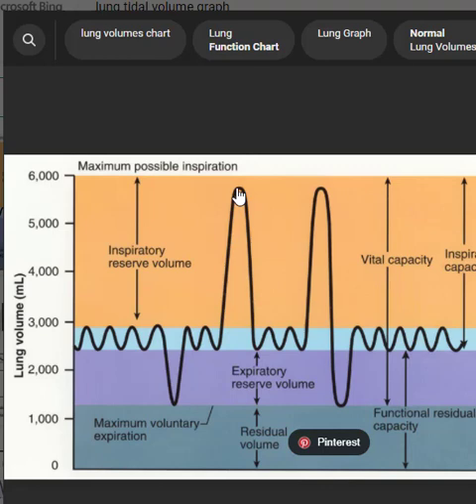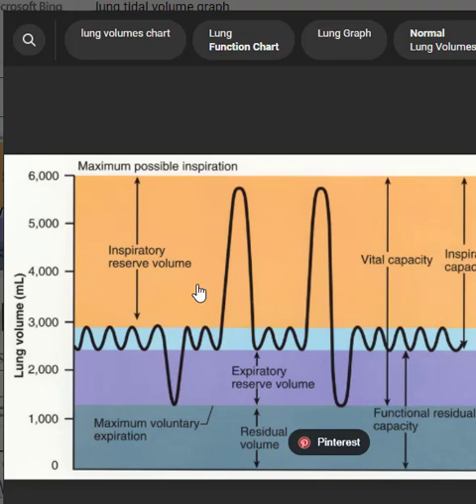Then you go back to tidal volume again, and then you say 'take the deepest breath you possibly can, fill your lungs as full as you can.' You go all the way up. To measure the inspiratory reserve volume, you start at the top of the tidal volume and go up to the peak. That's your inspiratory reserve volume. Add the expiratory reserve volume, tidal volume, and inspiratory reserve volume together and you get your vital capacity.